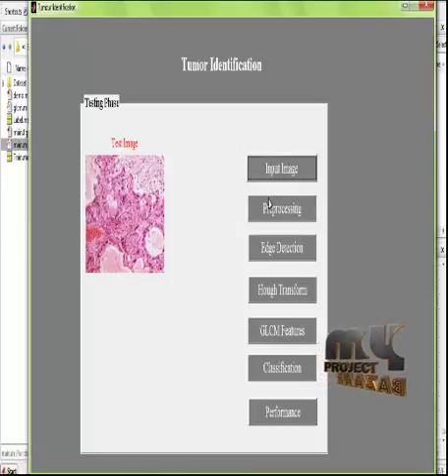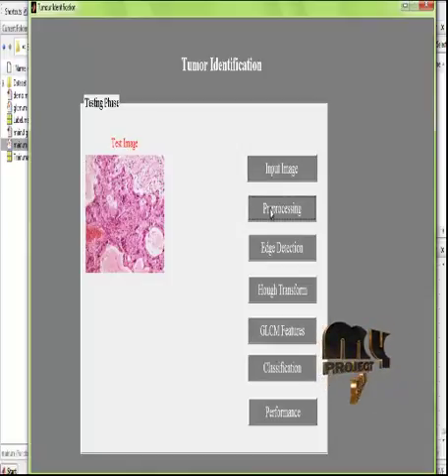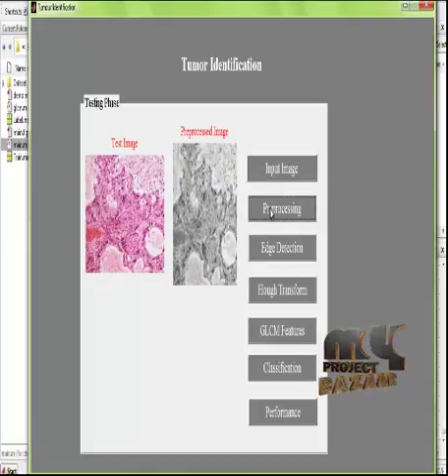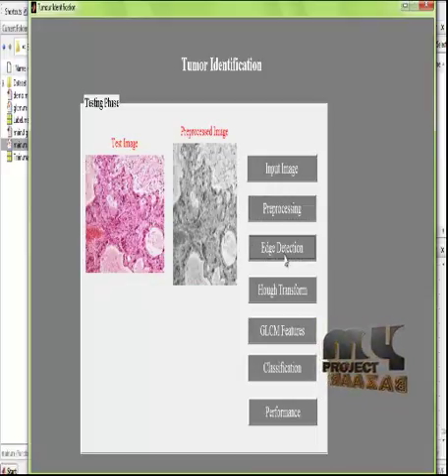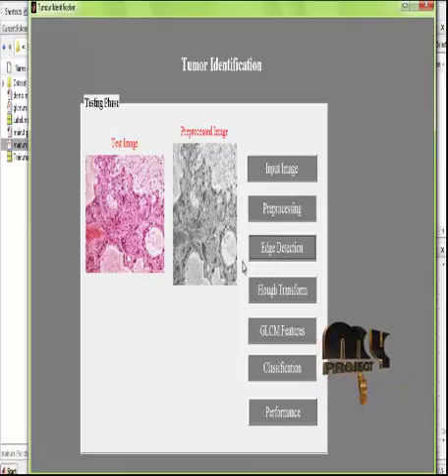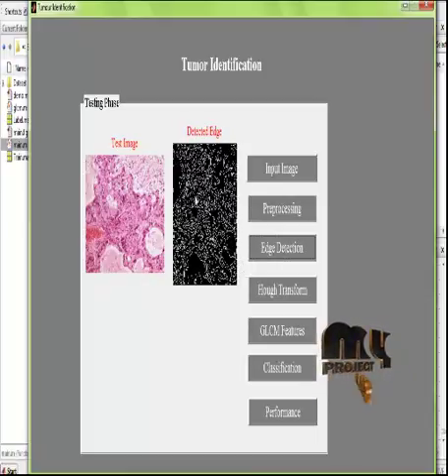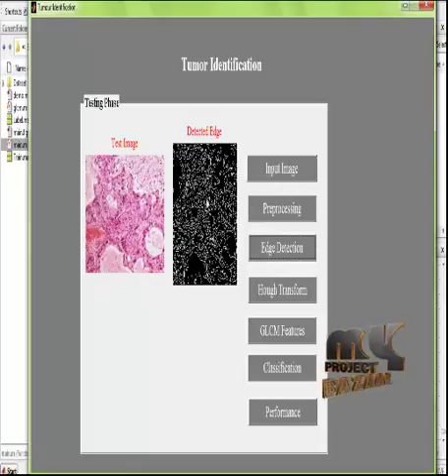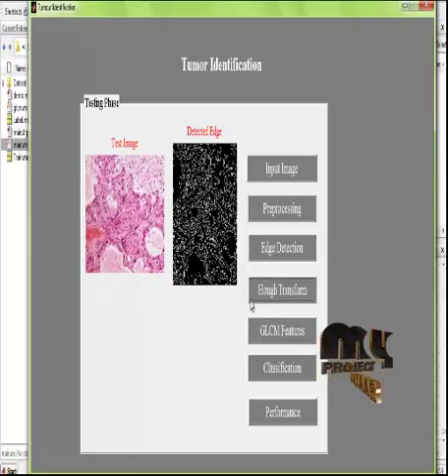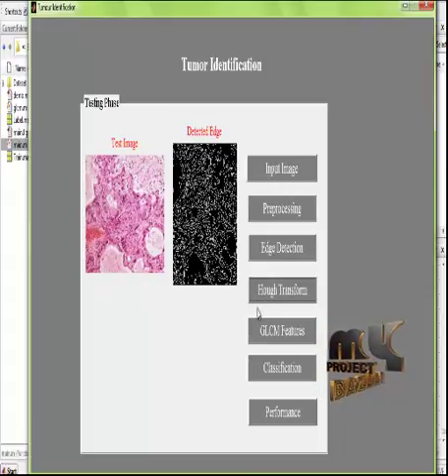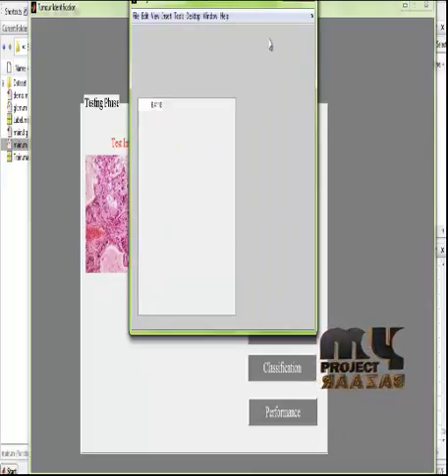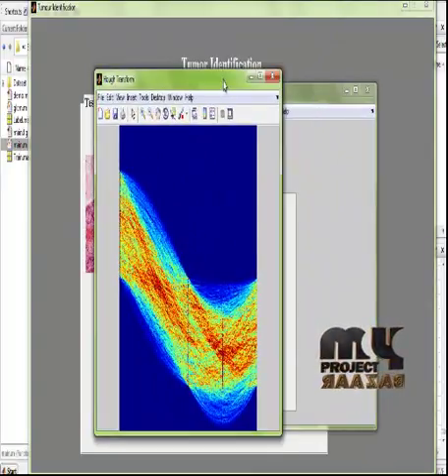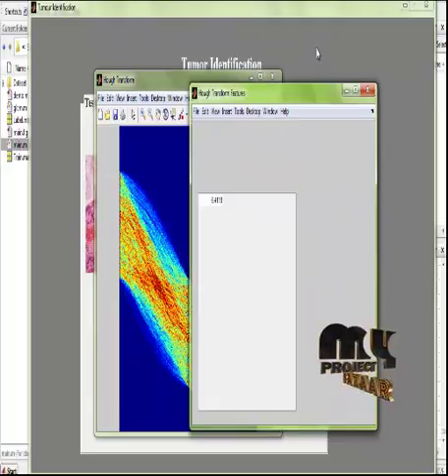First, we select any one of the input images. After that, the preprocessing step is employed, in which gray conversion, resizing, and filtering are applied. Then, edge detection is employed, where the Canny edge detection operator detects the edge regions in the input images. Hough transformation is applied to the images to identify the texture-based information.